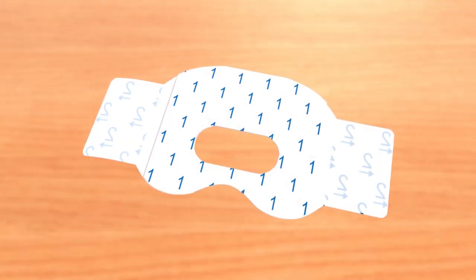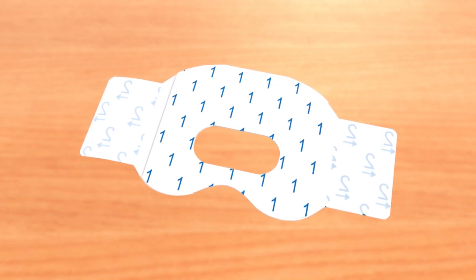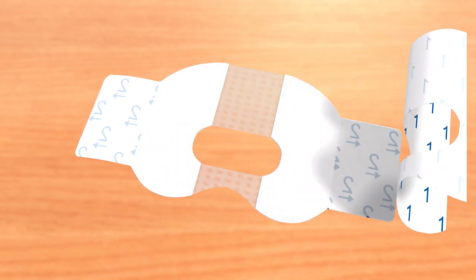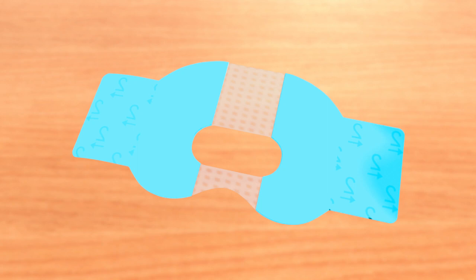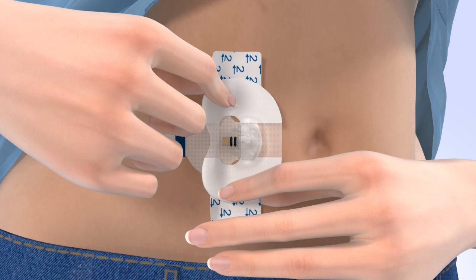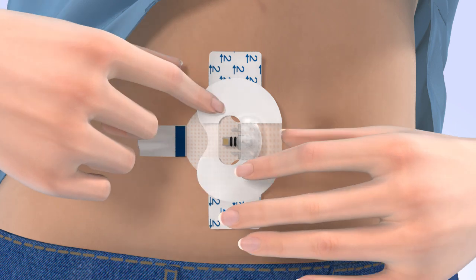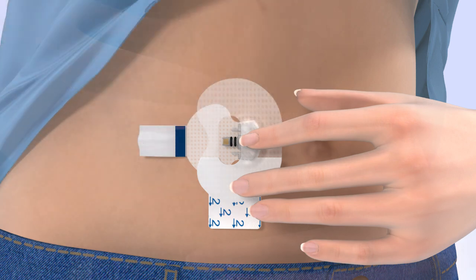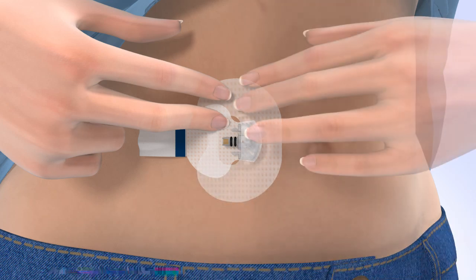Next, you need to apply the oval tape. It is important to properly secure the sensor against your skin. The first step is to remove the paper backing marked with the number 1. Do not remove the two smaller tabs on the sides of the tape just yet. Hold the oval tape by the covered ends. Then apply the wide part of the tape so it covers both the round side of the sensor and the skin securely. Make sure the tape is covering both the skin and the sensor. Then apply the remaining part of the tape onto the adhesive pad without blocking the sensor connector. Smooth down the tape that was placed on the skin. Then remove the paper tabs marked with the number 2 from the sides of the tape. Smooth the tape against the skin.